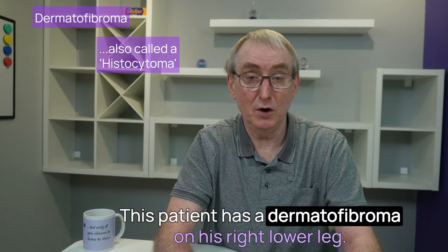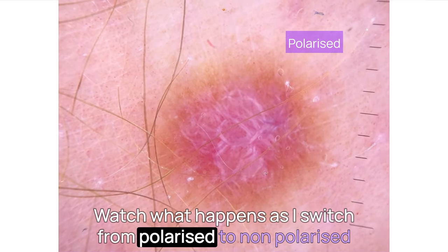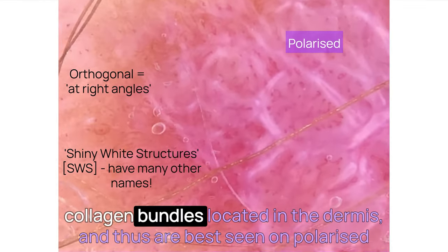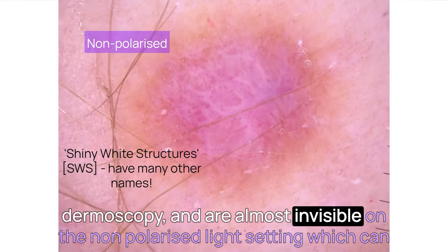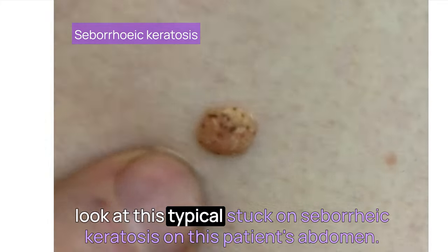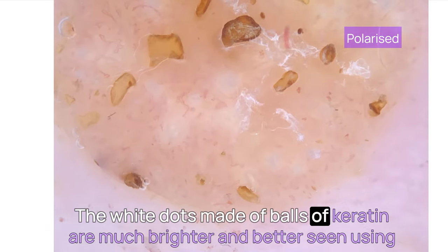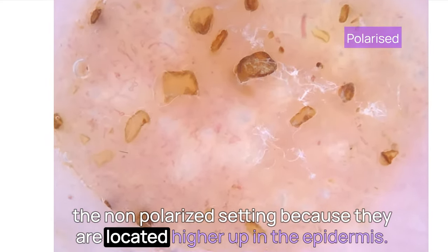This patient has a dermatofibroma on his right lower leg — we'll be devoting a whole video to these later on. Watch what happens as I switch from polarised to non-polarised light and then back again. These orthogonal white lines, or shiny white structures, are made up of altered collagen bundles located in the dermis and thus are best seen on polarised dermoscopy. They are almost invisible on the non-polarised light setting, which can only see higher up in the epidermis. Look at this typical stuck-on seborrheic keratosis on this patient's abdomen — note what happens when I switch between the modes. The white dots made of balls of keratin are much brighter and better seen using the non-polarised setting because they are located higher up in the epidermis.